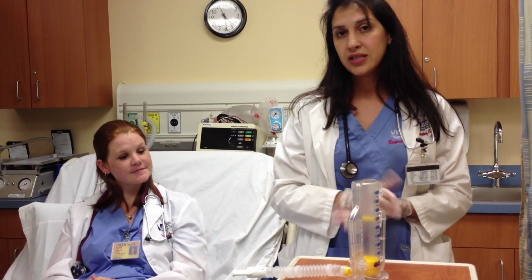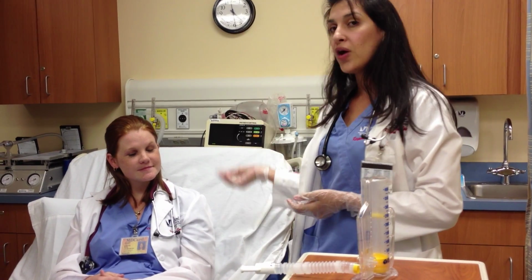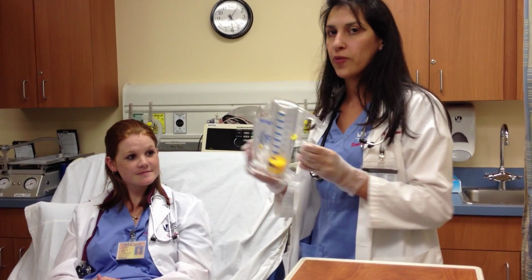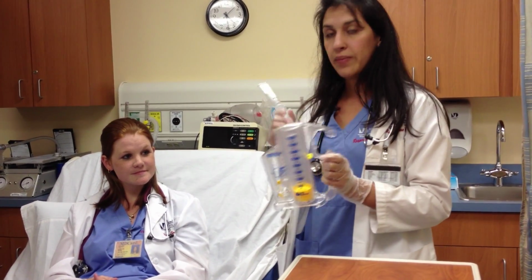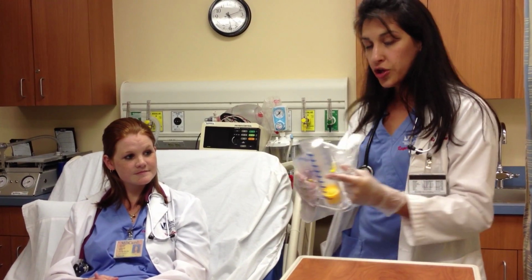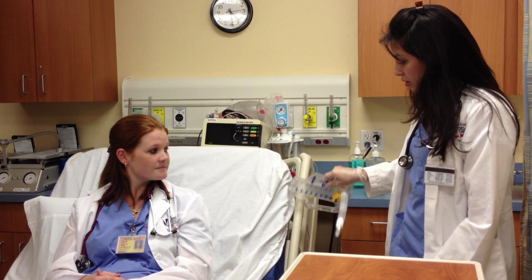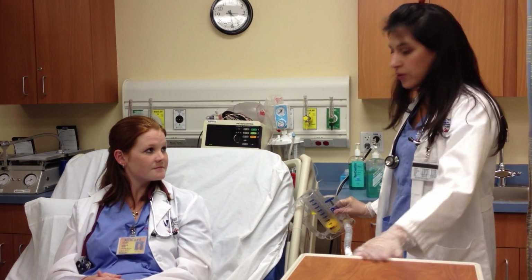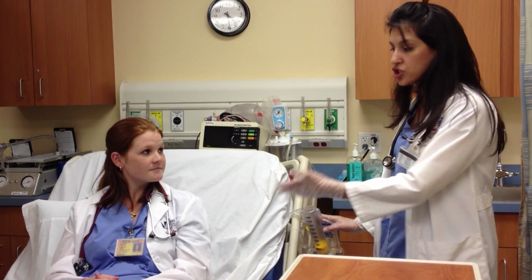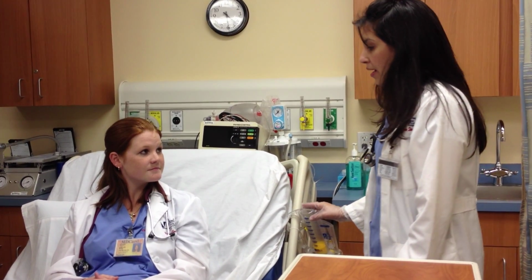After I'm done making sure that my patient has demonstrated to me that she could use incentive spirometry and that she could follow instructions, I need to make sure that this breathing device is reachable for my patient. I want to make sure that it's in reach for her. You could put it on the side of the bed, or you could put it on the table. I'm going to be leaving it for her here. Since she's going to have a surgery, I want to make sure she has it very close to her.